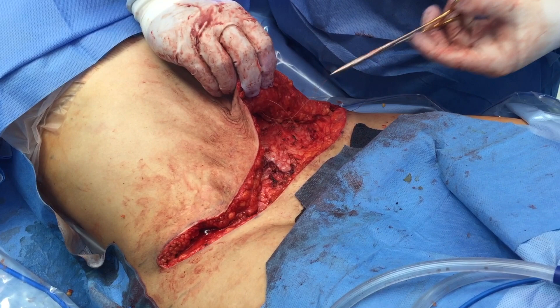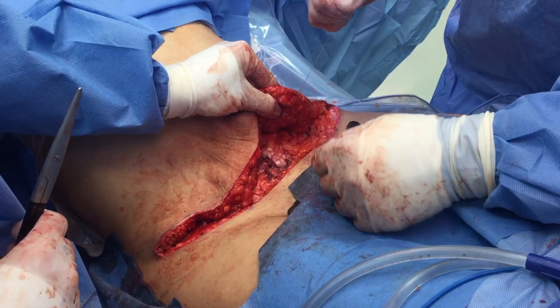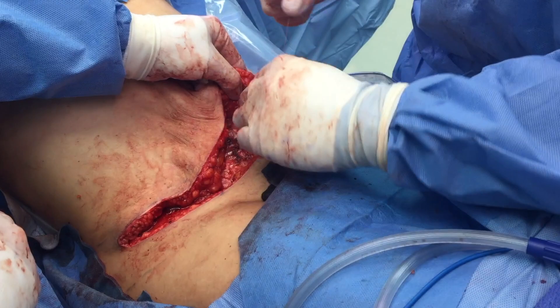Let's go ahead and cut this stitch off, please. My assistant's going to show me my knot — she's going to come right here — and we're able to really nicely put this knot down. You'll see how much additional tension it takes off of the incision. You get a lot less scar migration, it seems, at least anecdotally. Let's go ahead and cut that, please.